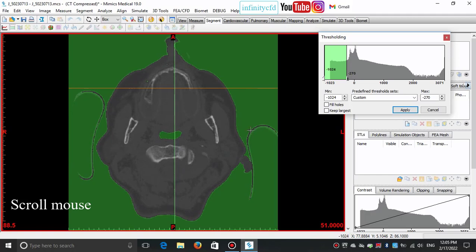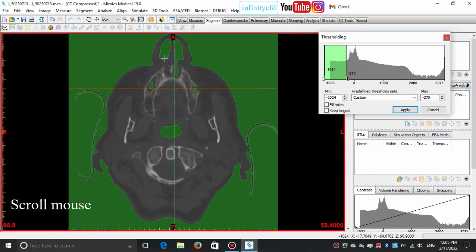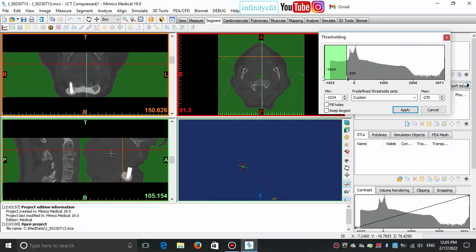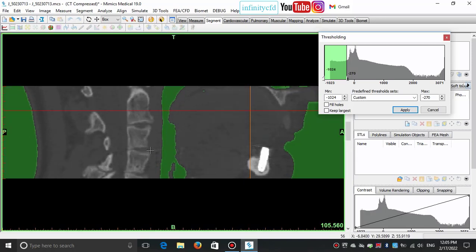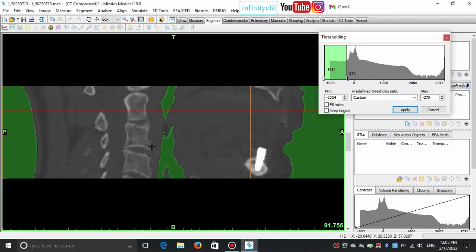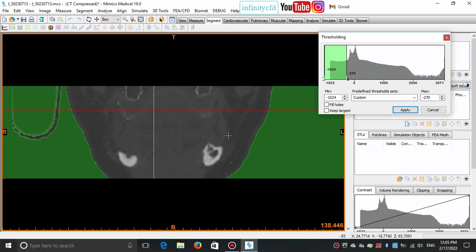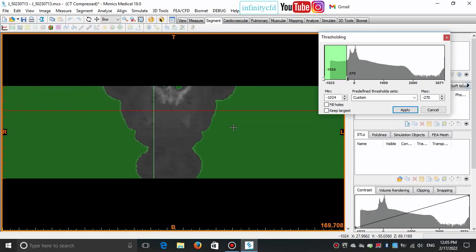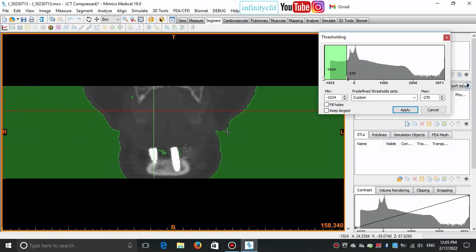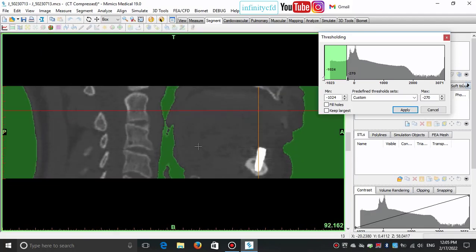I check it out by moving through slices using the scroll mouse button, and also in the sagittal plane. I edit the mask to get our desired geometry.